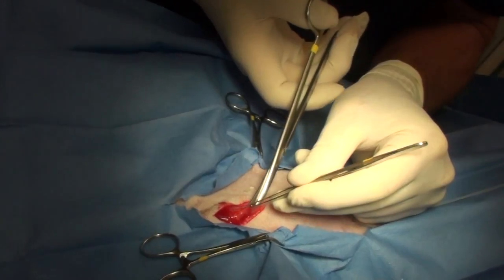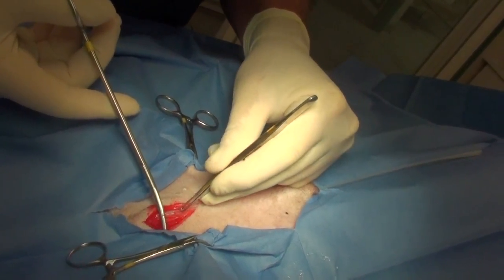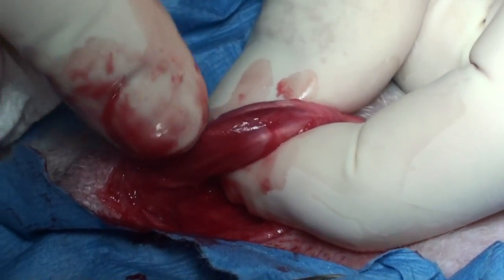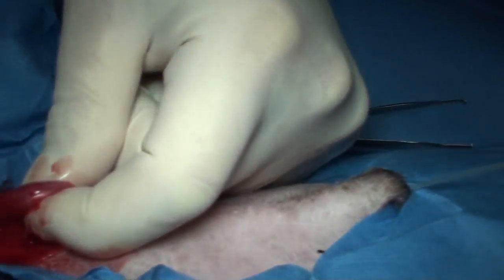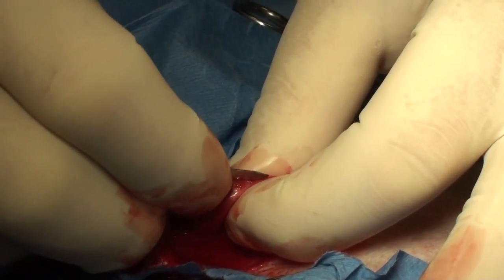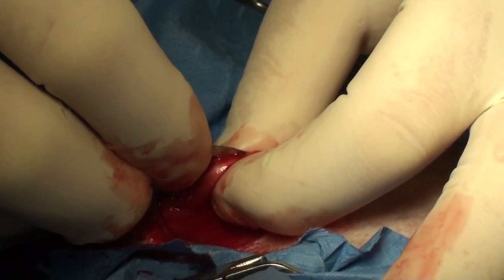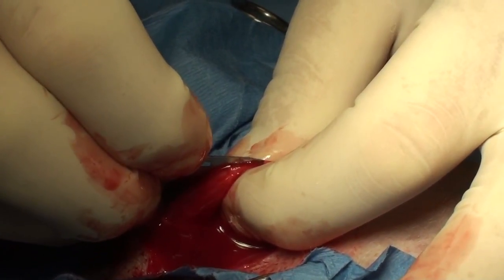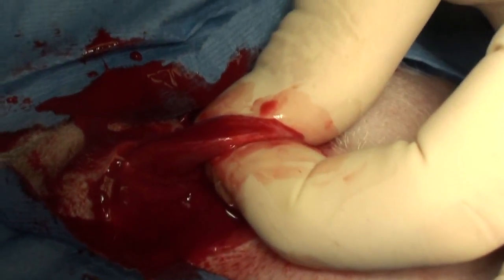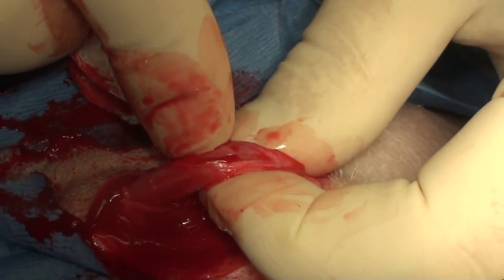We're going to make a cut right over the urethra — cut down, get rid of most of the tissue, there's the muscle, and move it to the side. You can see the catheter going in; I can feel the catheter right in the urethra, and there's the penis underneath of it. So I'm going to make a cut right over the catheter.